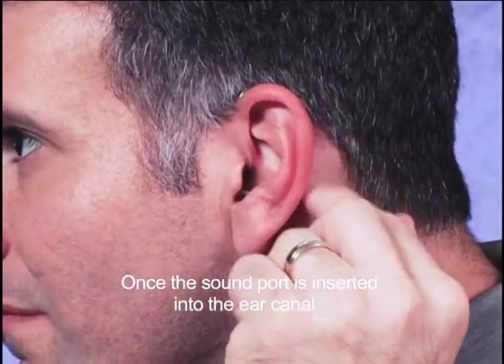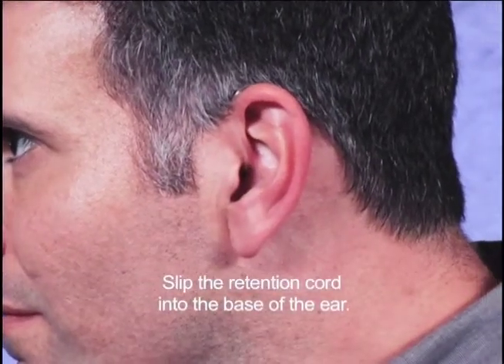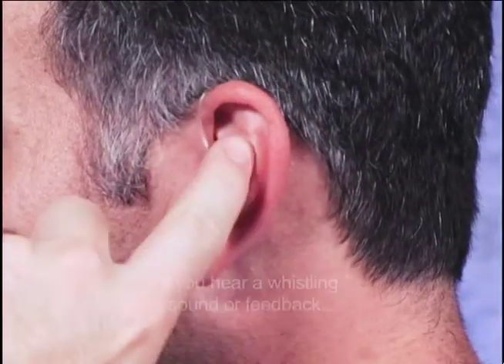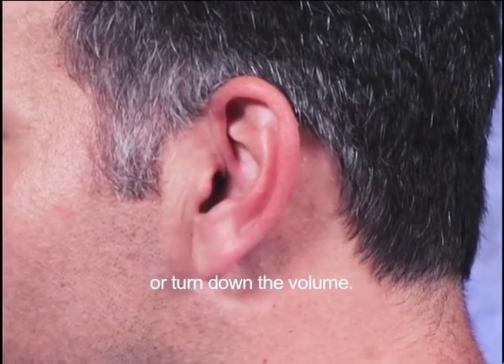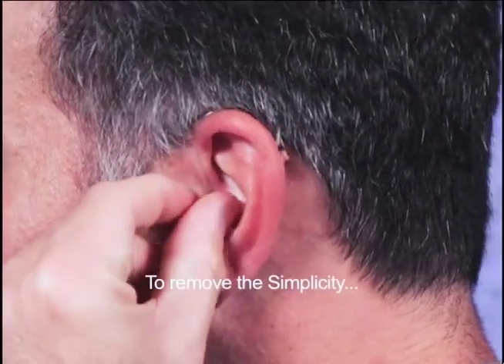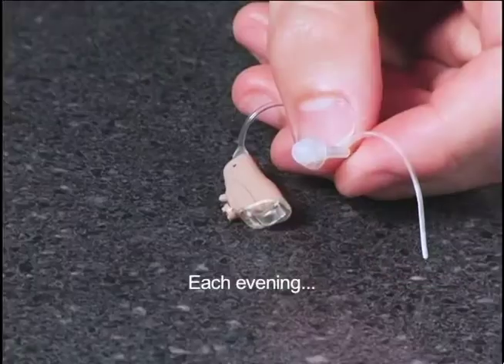Once the sound port is inserted into the ear canal, place the body just behind the top of the ear. Slip the retention cord into the base of your ear. When correctly installed, this is the way Simplicity will look in your ear. If you hear a whistling sound or feedback, gently push on the device to ensure that it's properly seated or slightly turn down the volume. To remove the Simplicity from your ear, simply grasp the tubing between your thumb and forefinger and slowly pull it out while lifting over the ear.